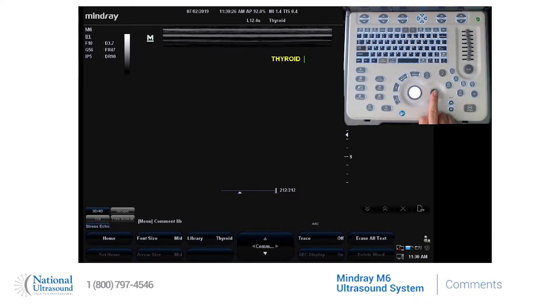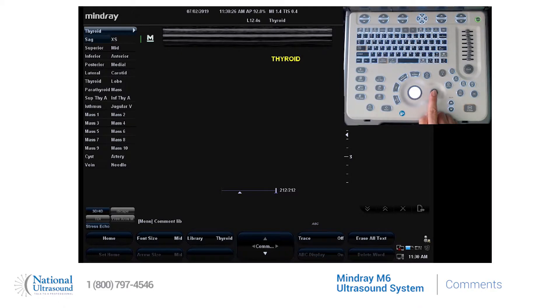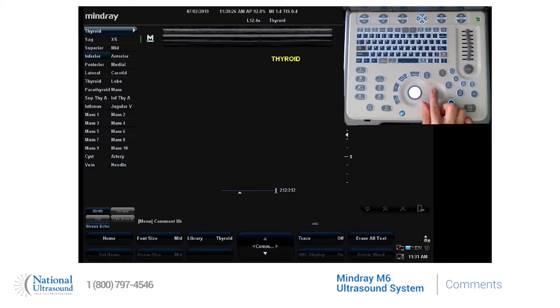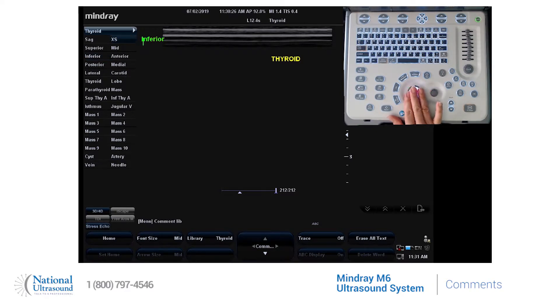You can also press down on the multifunctioning knob to the right of your trackball and a menu will appear. You can then rotate this knob to the particular term that you want. Press down on the knob and it will enter the word on the screen.